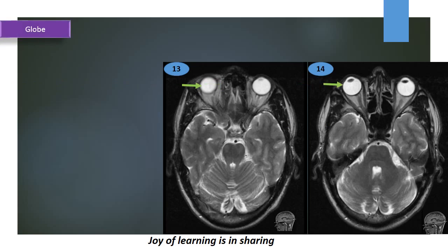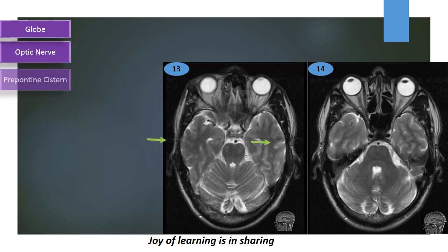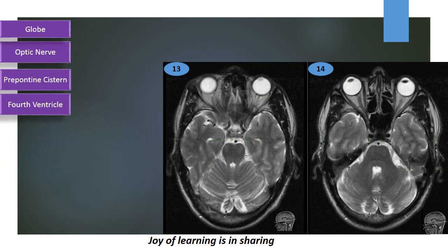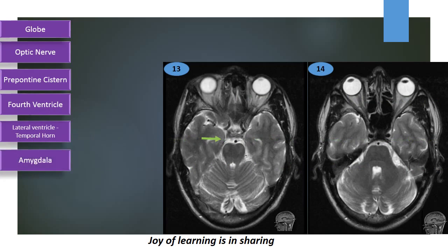Optic globe, optic nerve, prepontine cistern, fourth ventricle, lateral ventricle with its temporal horn, amygdala, hippocampus.